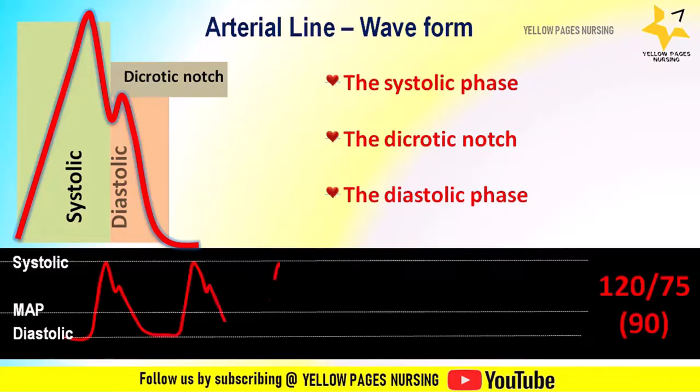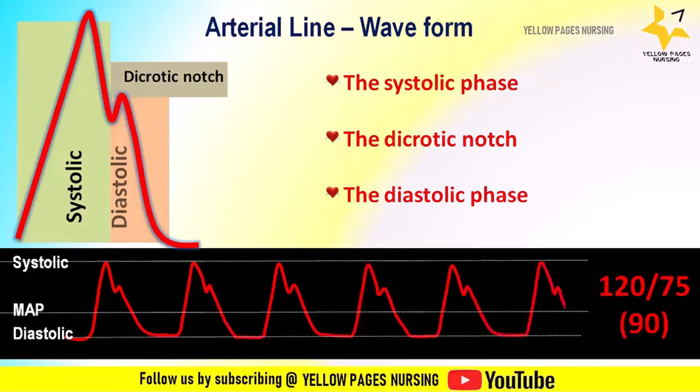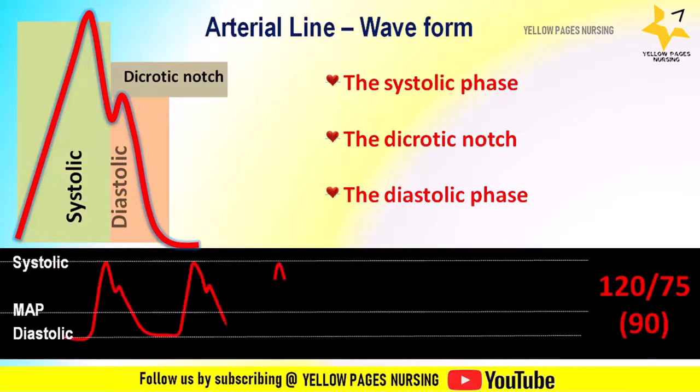This is the normal waveform graph for your reference, and here you can see the systolic, diastolic pressure and the MAP.